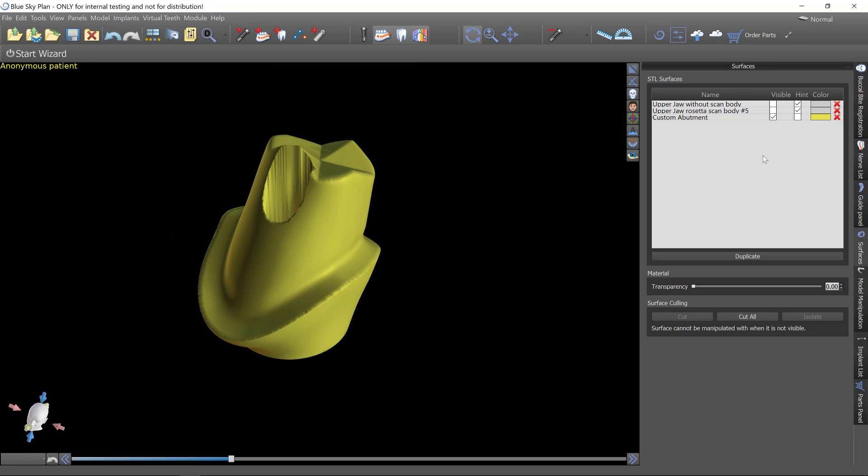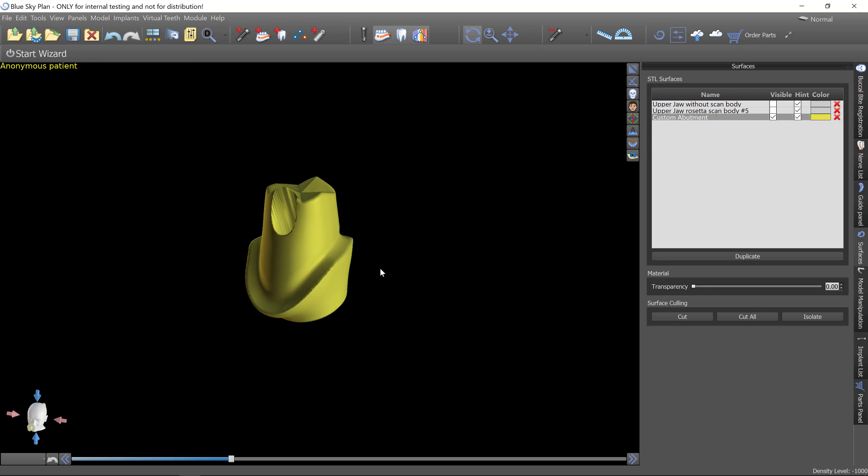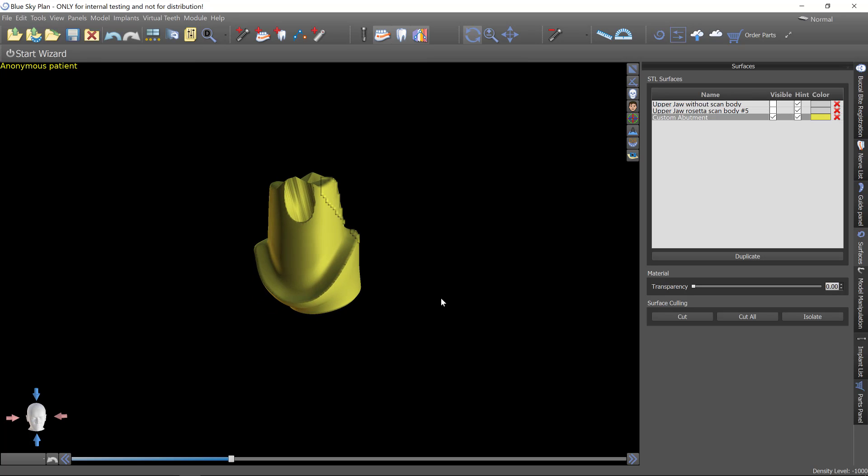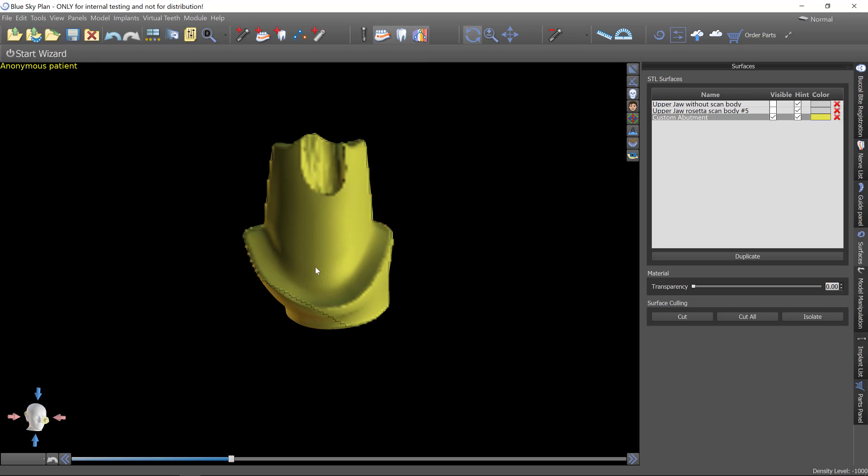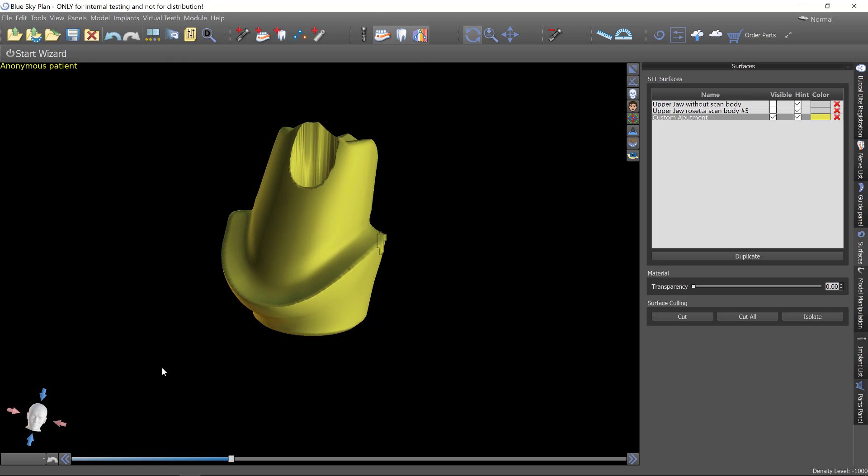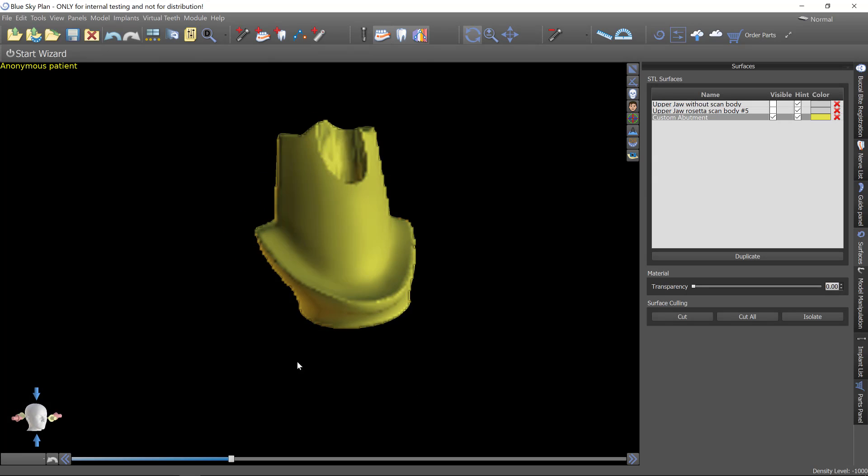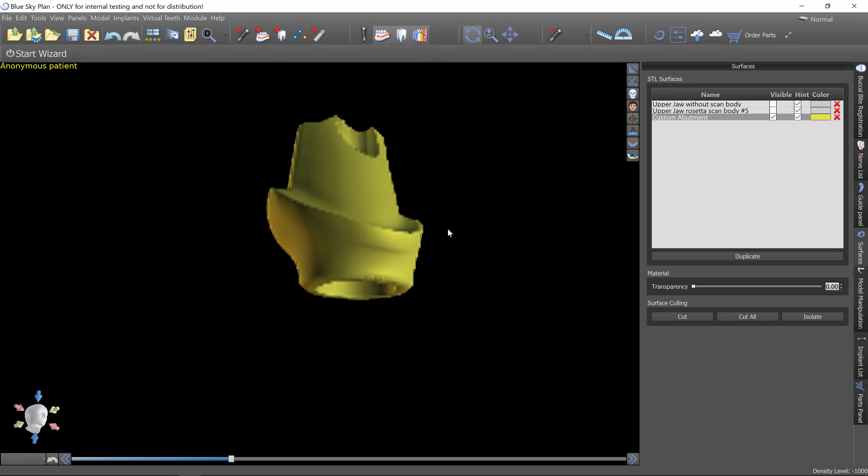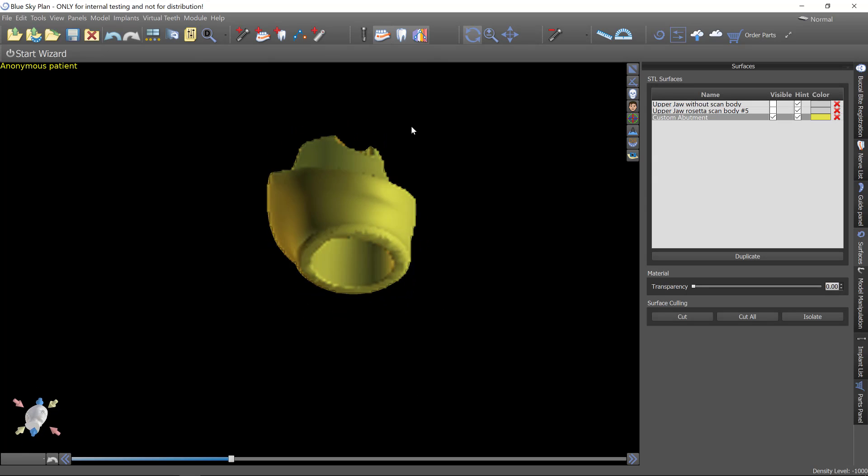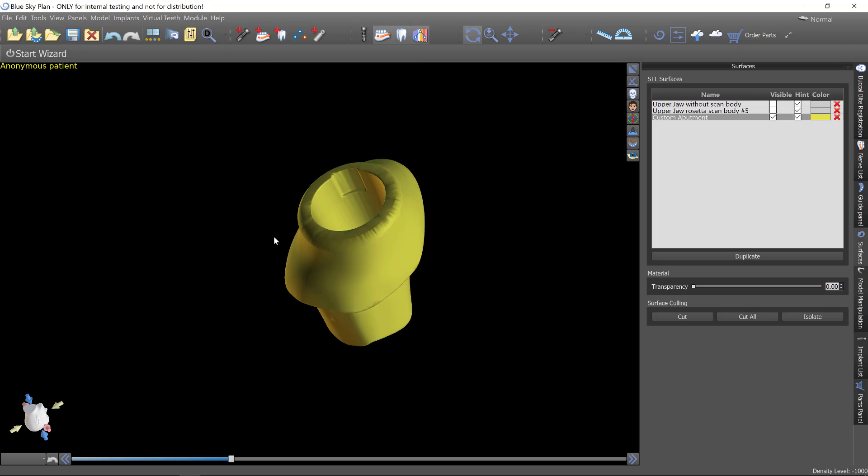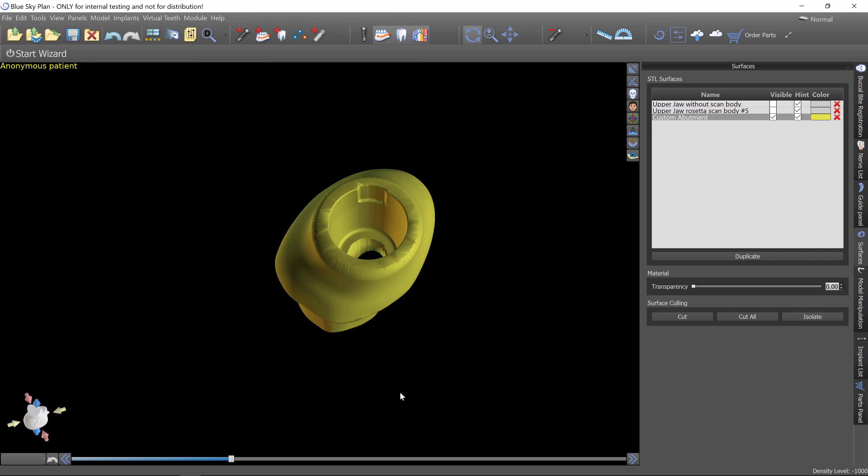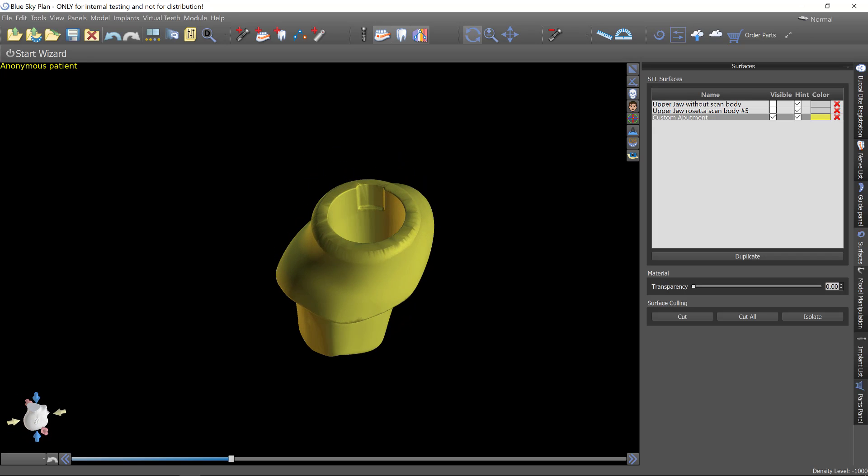And again, you could turn on the custom crown back in the denture module. So these are files that could be printed. They could be milled. And this now gives users a Blue Sky Plan an option to create their own prosthetics. And this will only get better as we go forward in time. So let us know what you think about the initial versions.